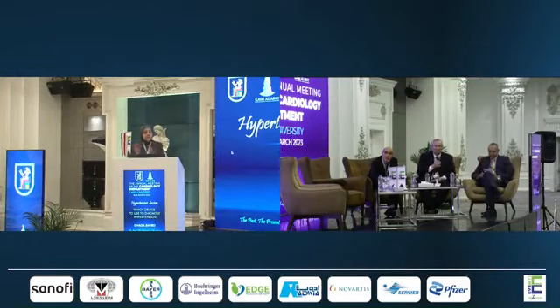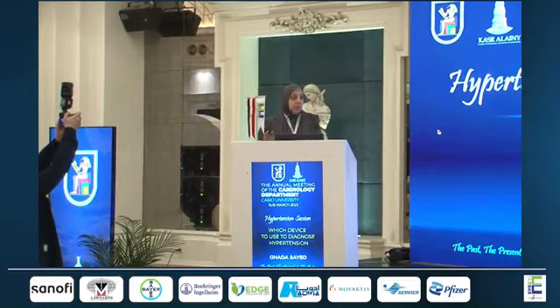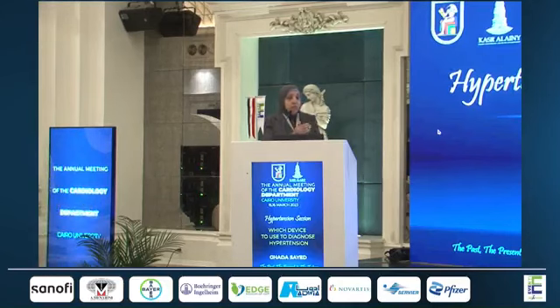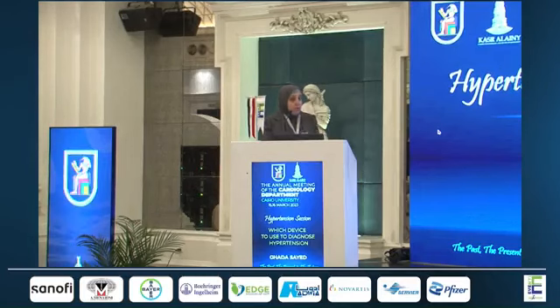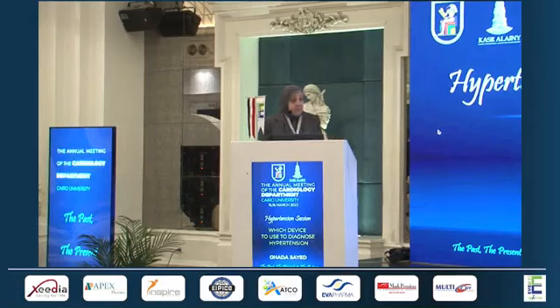It's the same difference as between office measurement of blood pressure and the ambulatory blood pressure measurement. Of course, the definition of hypertension will change because of the change of the location or circumstances of measuring blood pressure. So I think there is not yet a threshold for diagnosing hypertension by automated device, but we can assume that the threshold is similar to the daytime, which is more than 135/85.